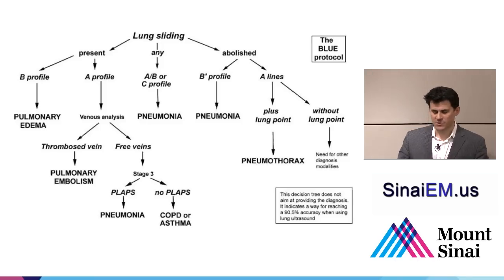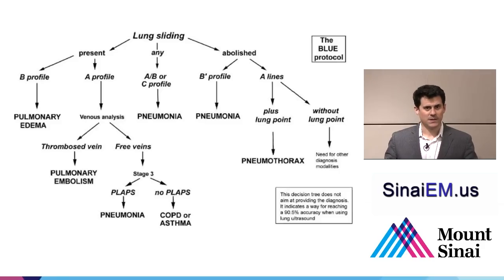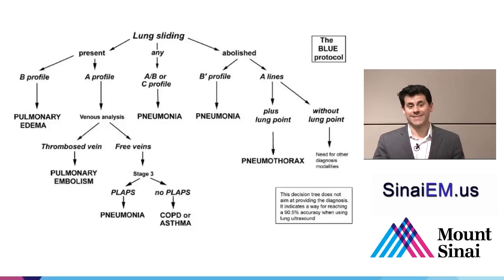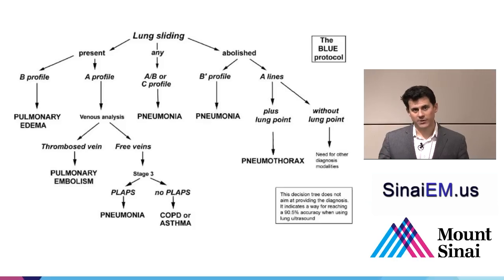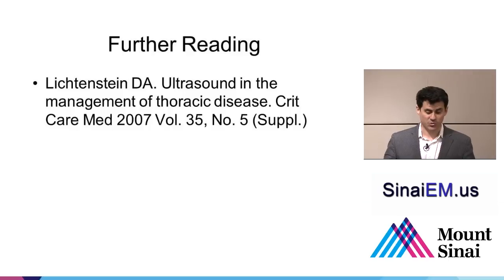Here in his assessment, he describes looking at the veins, which is beyond the scope of this talk, but the idea being if you have a patient who's acutely short of breath, hypoxic, in respiratory distress, etc., and they have relatively normal-looking lungs, meaning there's no B-lines for pulmonary edema, there's no consolidation, and there's normal lung sliding, meaning there's not a pneumothorax, pulmonary embolism should be considered, and a great way to look at that at the bedside is to look for DVT. So again, pulling it all together, you can get a pretty good assessment of what the possible diagnosis is for your patient who's acutely short of breath.